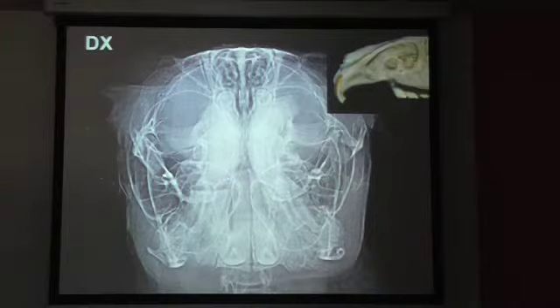And here you could see all these apical and corner elongation of the cheek teeth.